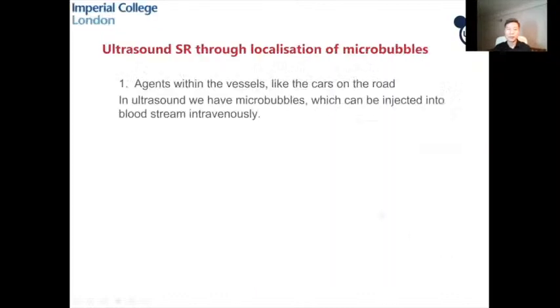For the first point, the agent within the vessel, in ultrasound we have microbubble contrast agent, which can be injected intravenously into the bloodstream. So that's a tick. Second, we need a way to turn the surrounding tissue dark.